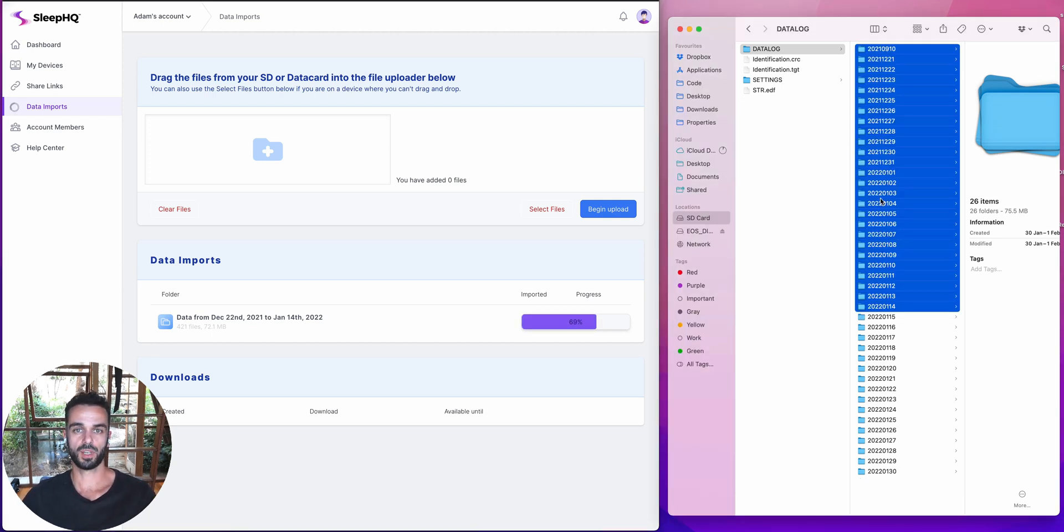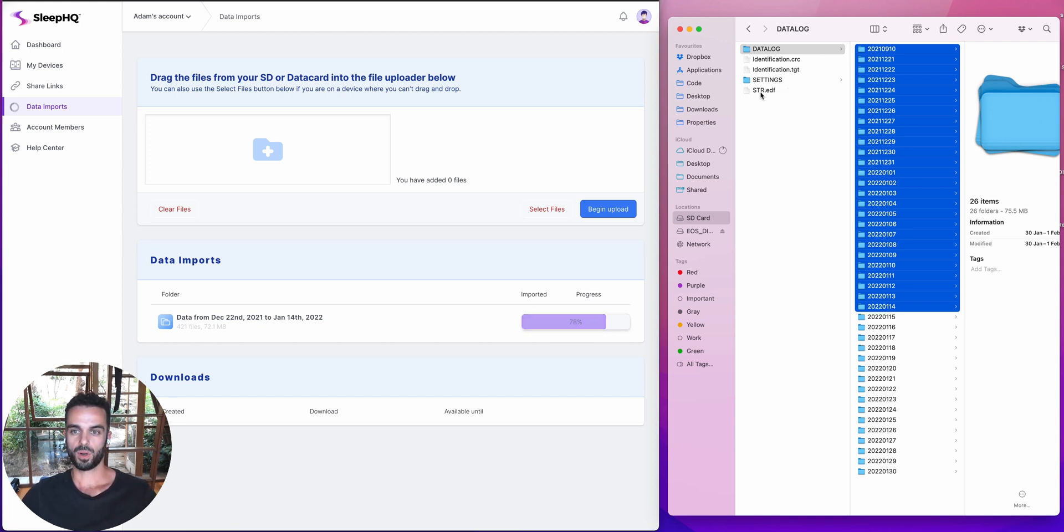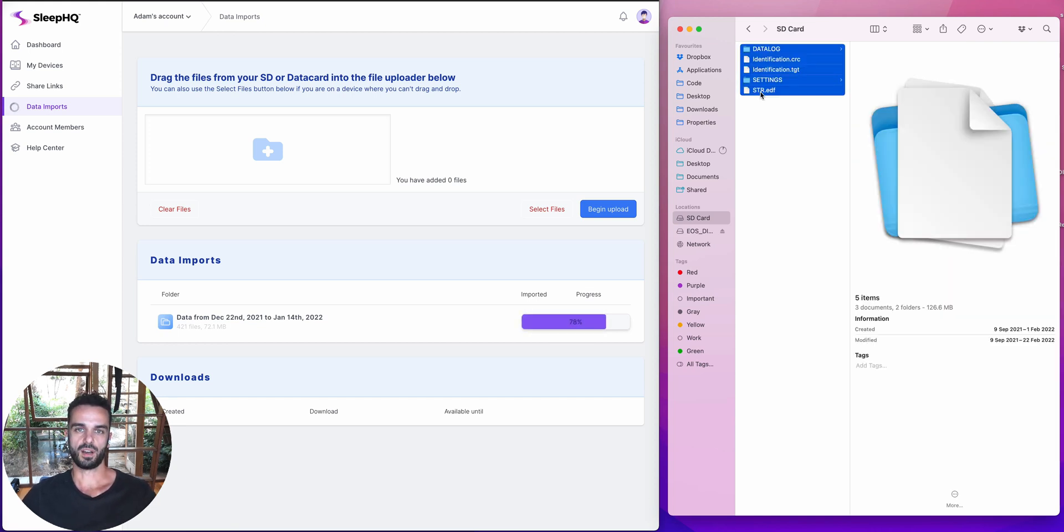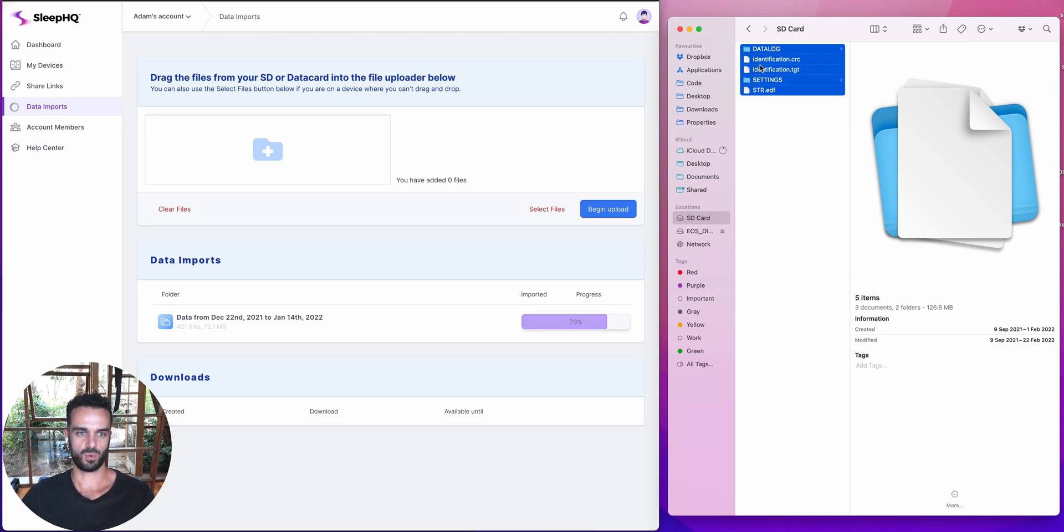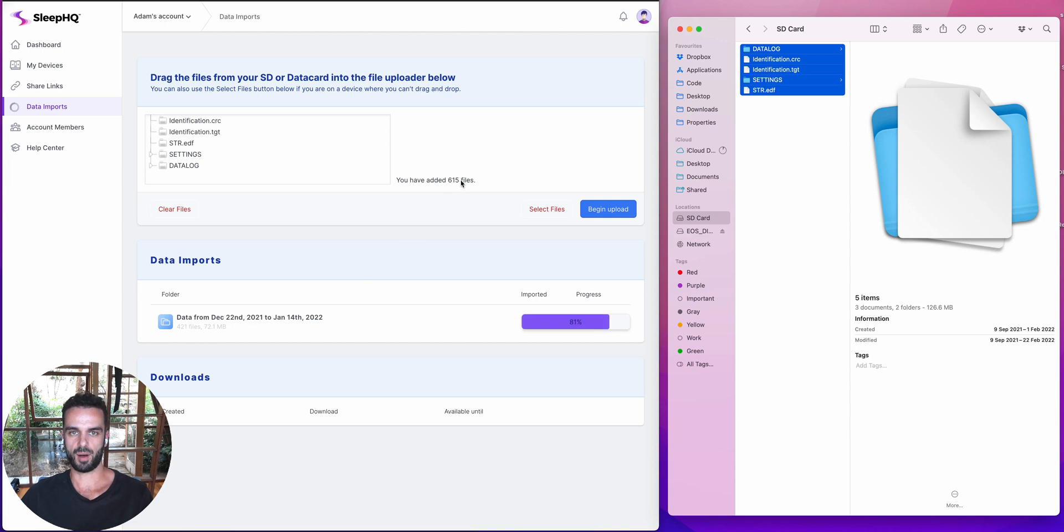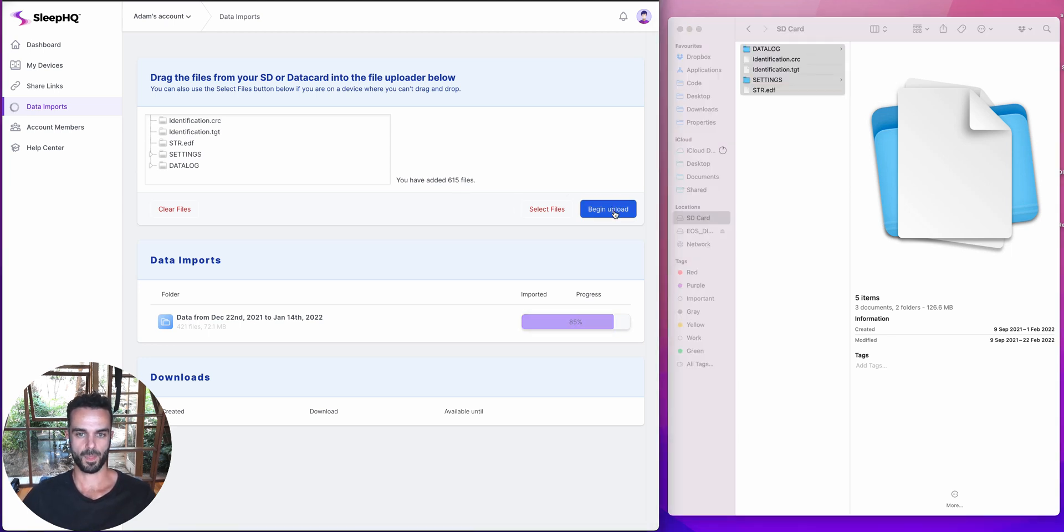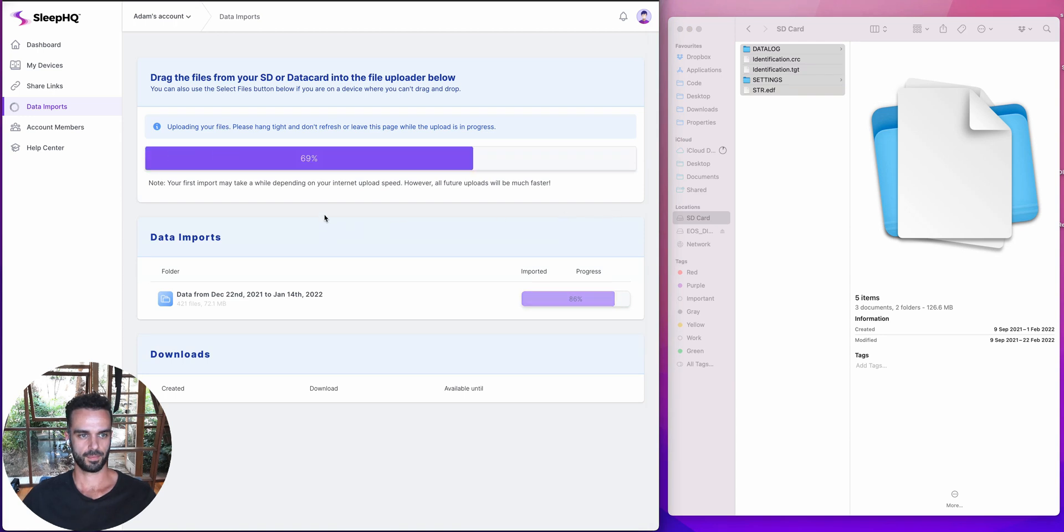So what I'm going to do now is I'm going to drag in some more data. But what we do when you do your uploads, Sleep HQ registers all of the files that have already been processed. So what that means is that I can drag in everything from my SD card. So watch this. I'm just going to drag the whole SD card across and it's telling me that I'm uploading 615 files. So my last one, I uploaded 421. This time I'm uploading 615 files. So it's telling me that I'm uploading more files because it's got everything from my SD card queued and ready to go. But watch what happens when I click begin upload.